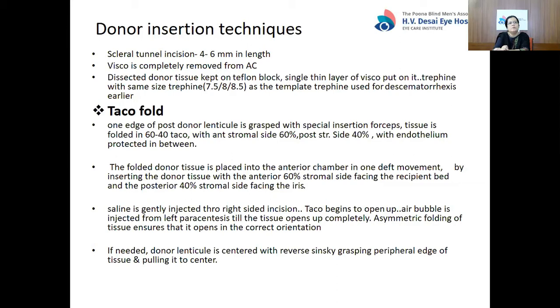The initial technique for donor insertion is called the taco fold. One edge of the posterior donor lenticule is grasped with special insertion forceps. Tissue is folded in a 60-40 taco fold with the anterior stromal side at 60% and posterior stromal side at 40%, with the endothelium protected in between. The folded tissue is inserted into the AC in one swift movement with the anterior 60% stromal side facing the recipient bed and the posterior taco facing the iris. Saline is gently injected so the taco begins to open, then an air bubble is injected until the tissue opens up completely.